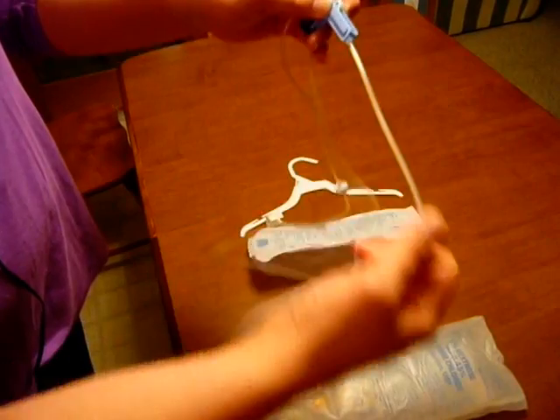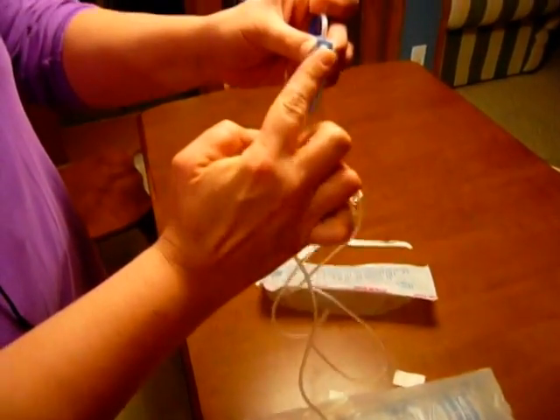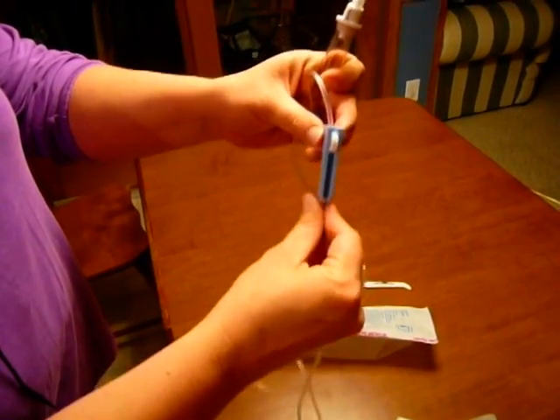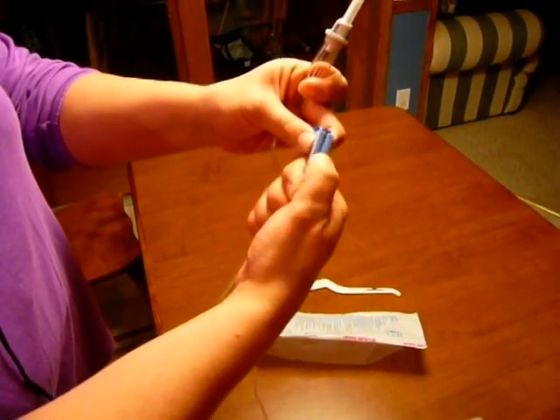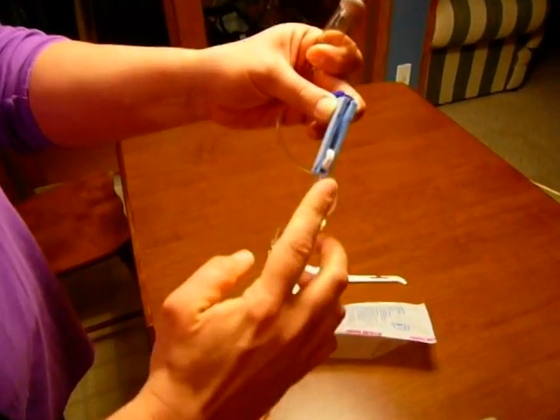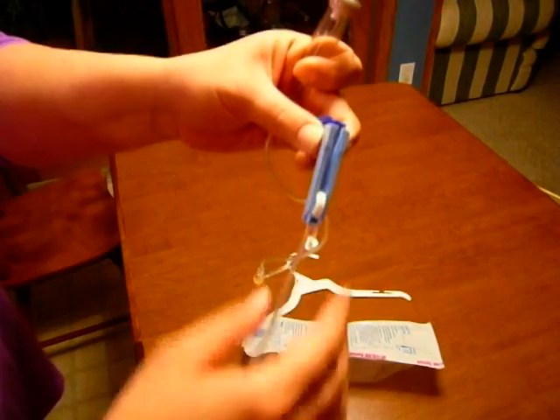The next thing I need to do is move the roller clamp up. The roller clamp is open or up like this so it's able to be moved. I'm going to move it up to the top of my tubing and then I'm going to roller clamp it down like this. This is closed so that there will be no leaking of fluid until I'm ready.